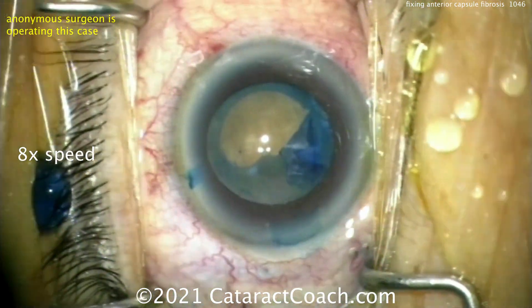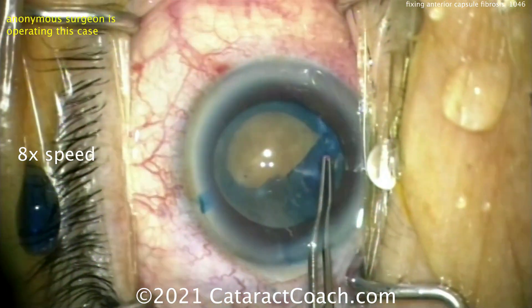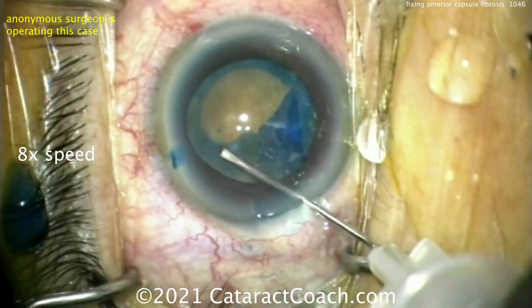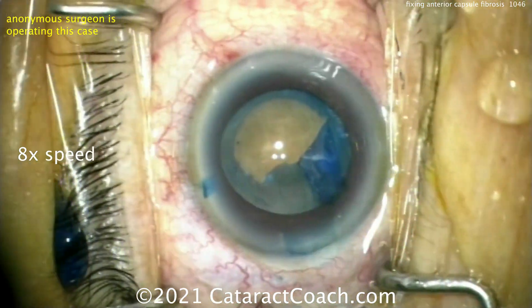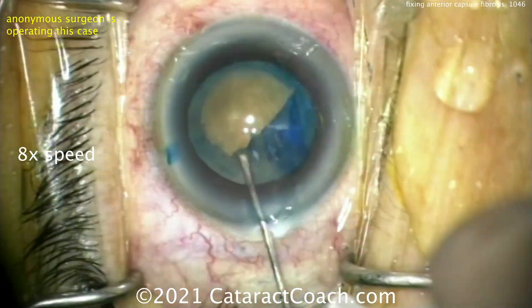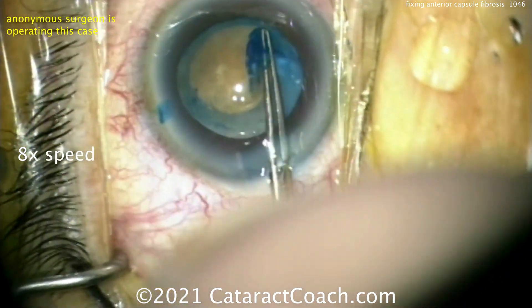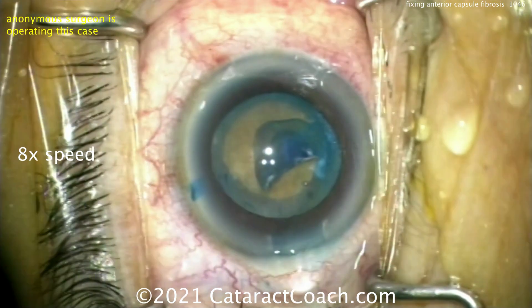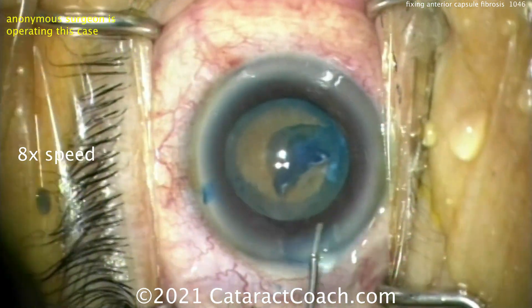With this fibrotic capsule, we try to get the rhexis but can't quite get it. We get stuck, put in more viscoelastic, try to pull — it's just stuck, nothing's going. We go the other direction, bring it across, get the forceps, but it's still stuck at one point. Try again, bring it around, and it can't be completed. So we use scissors, make a cut, and you can see that fibrotic capsule can be cut.